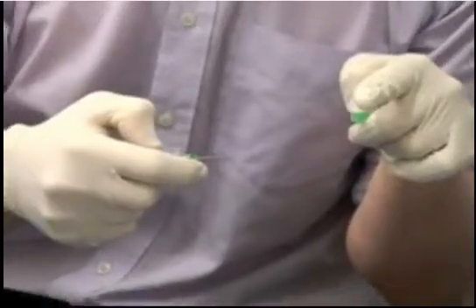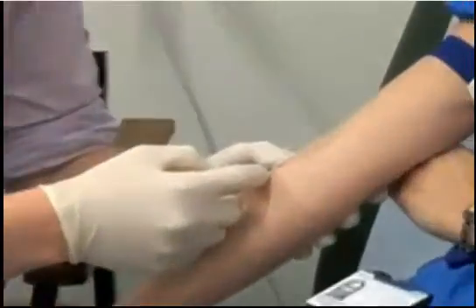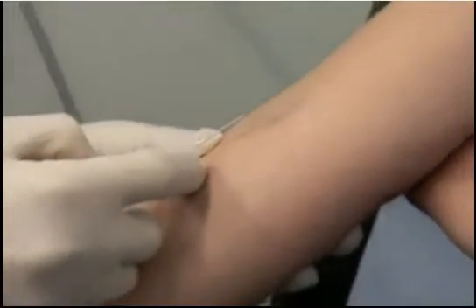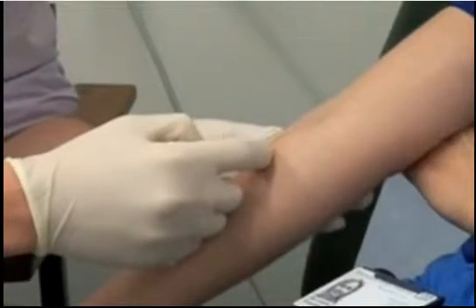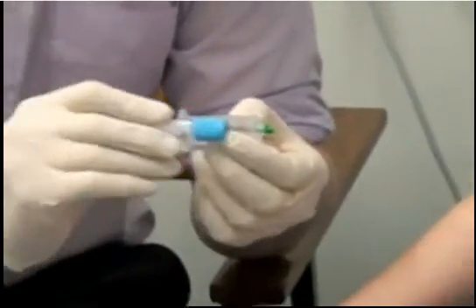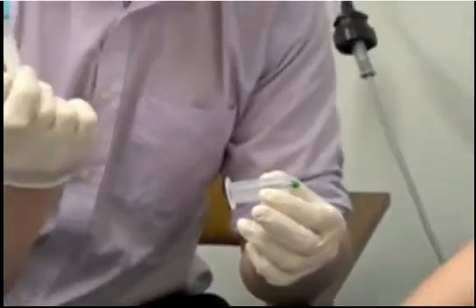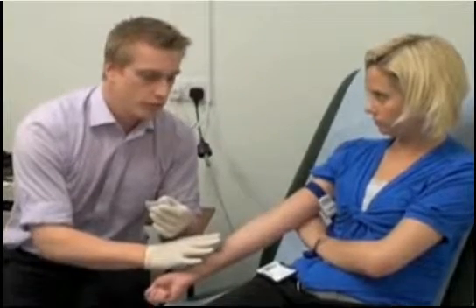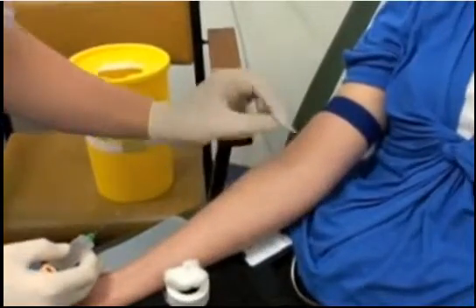With the bevel pointing up you can see the full cut surface of the needle. Approach the patient at an acute angle in the direction of the vein, using your thumb to stabilize the skin. Push the needle through the skin and hold it steady. Once in the vein, push the blood bottles through the bottom of the device — they automatically fill due to the vacuum inside, which sucks the blood in.